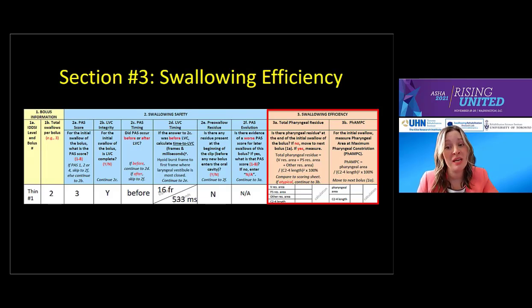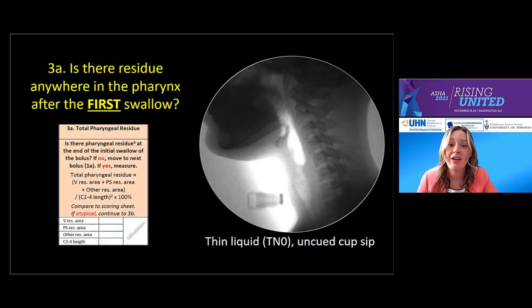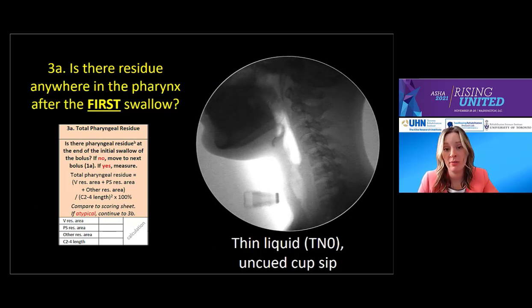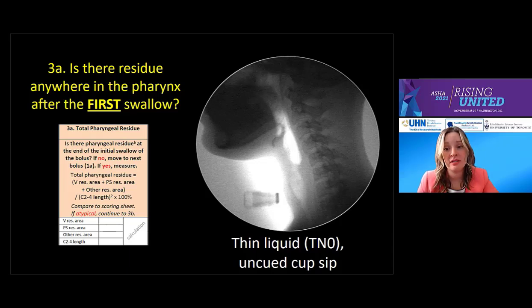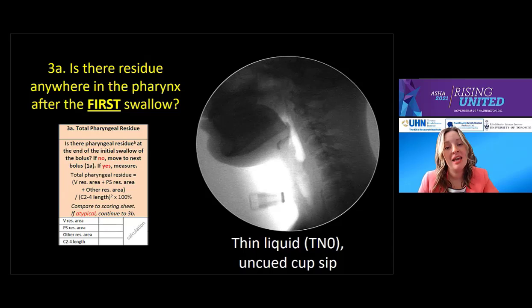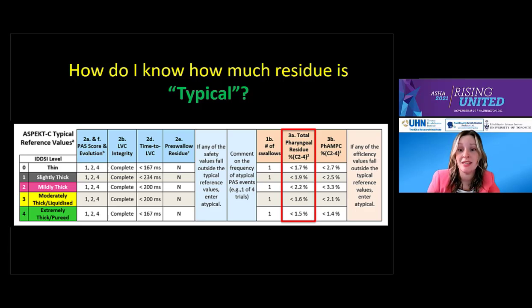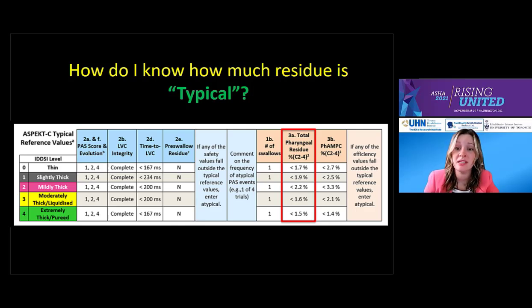Finally, let's look at the third section of the ASPECT-C tool: swallowing efficiency, in peach on your worksheet. This section asks: is there anything left in the vallecula, piriform sinuses, or anywhere in the pharynx at the end of the first swallow of a bolus? Watch the clip and ask yourself: is there residue after the first swallow, when the pharynx is most relaxed, on what we call the swallow rest frame? Here the answer is yes — we see residue in the piriforms. So the next question is: is that residue amount typical or atypical? Is it greater than 1.7% of the C2–C4 squared space?